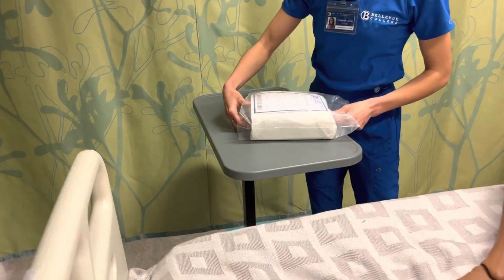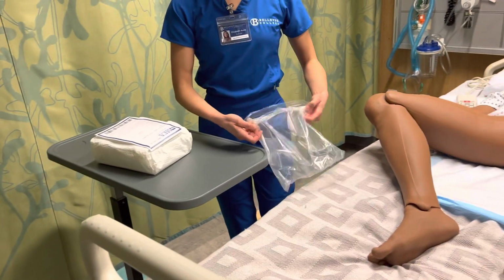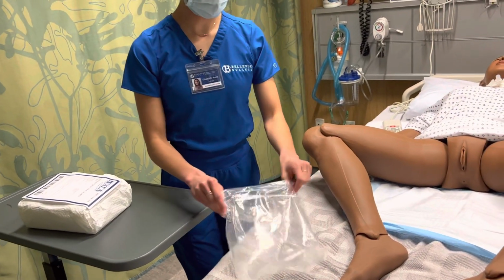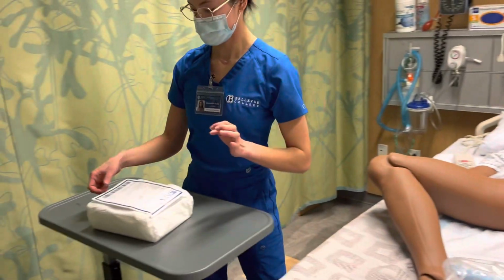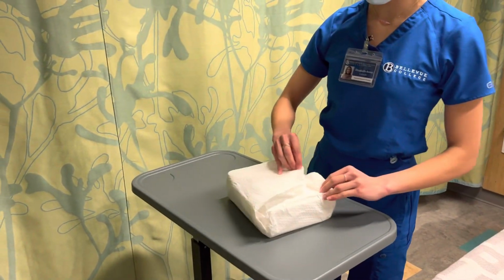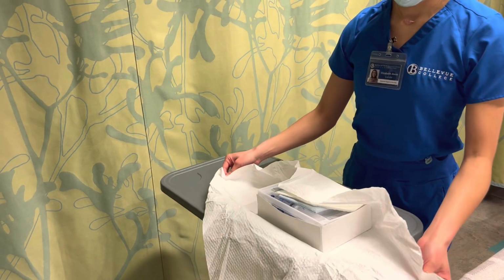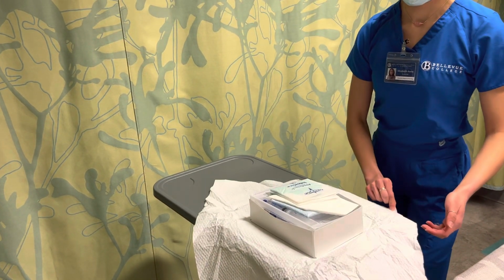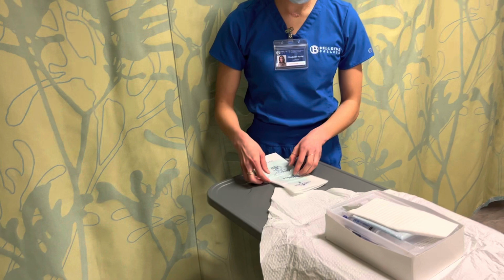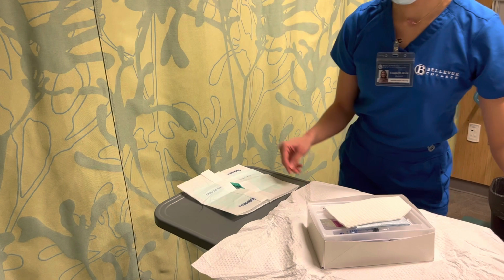We're going to open this away from us. Down, and then I can bring That's a little garbage can for myself. Right there. Toss this. We don't It's kind of in order. So like Okay. this is here. So we'll open away. Then this is here. Connect this. Use this. Then you're done with this tray. You can put. And then bring this. You can put the swabs in that tray. Oh, that's right. Yeah, you had it like this. Yeah. So then you're done with this, and then you take this. Yeah. Just get the syringe out.